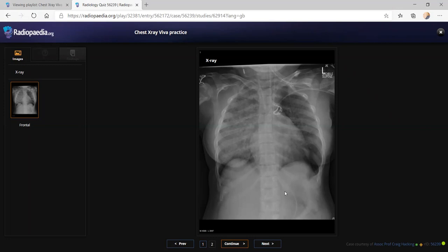Okay. What about the additional lung findings? The additional lung findings may be due to an infective etiology, or because of the cardiac condition there may be some regurgitation, which has resulted in right upper lobe patchy opacities. If the patient is having fever, I'll suspect an infectious etiology and suggest a cover of antibiotics and a follow-up chest radiograph after 4 to 6 weeks. And if there's no fever, then I'd like to go for a CT examination for better characterization of the pathology and take it up at the chest MDT. Okay.